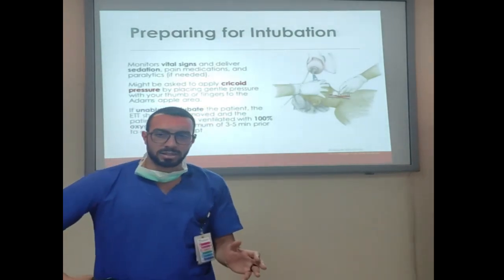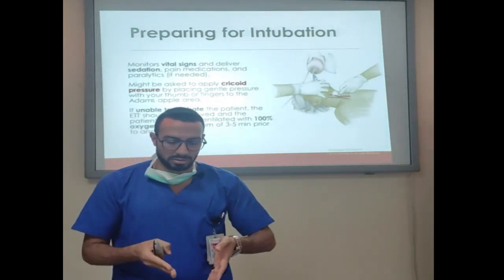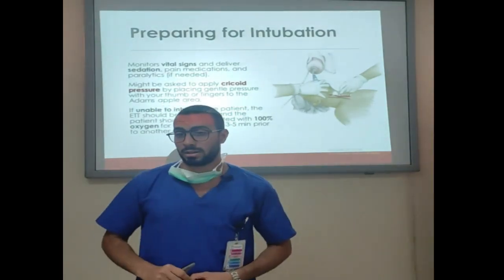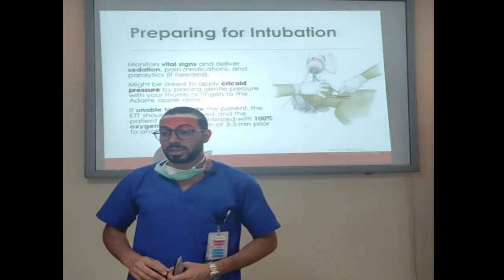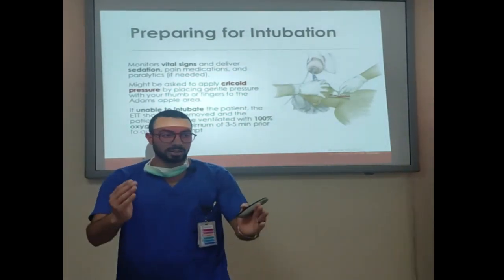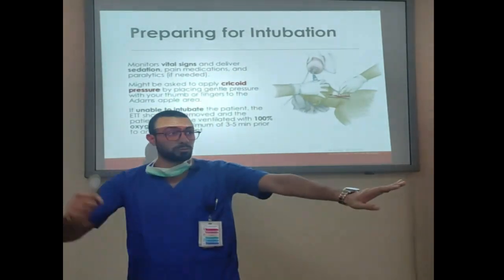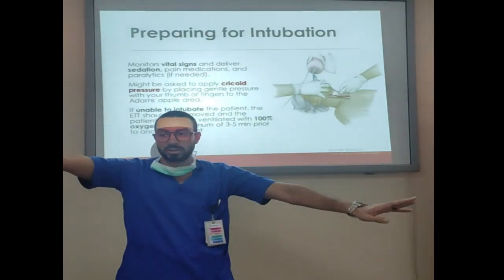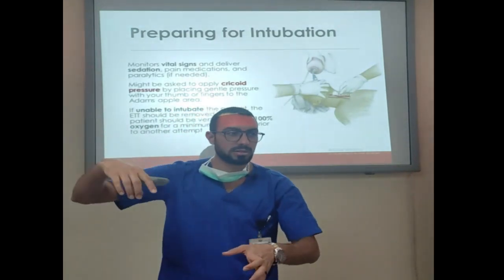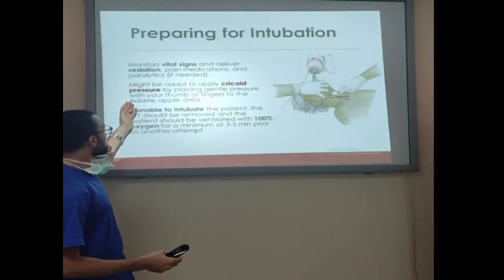When the doctor begins, you will give the induction, and then he will think about the airway, and you think about the patient to check the vital signs. If you have heavily decreased saturation because the doctor took a long time, you should stop the doctor: please doctor, just stop, we have 50 saturation, and try to support with oxygen with BMV, the bag mask valve unit, the bag mask ventilation unit.